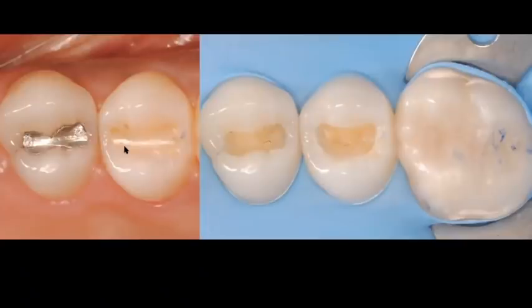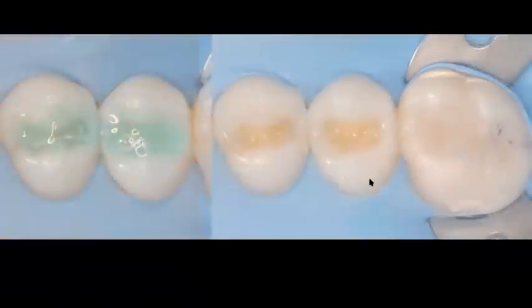You adapt them well to the tooth. They do adapt well to the tooth, but I don't see them functioning very well because they really don't have any tooth form or tooth shape. And the reason why they don't have it is because we're just placing 2 to 3 horizontal layers. We're making a flat restoration from the beginning. So the successive cusp buildup technique is a technique where we are going to change our mentality and go from that horizontal layering technique to a combination of a horizontal and oblique layering technique so that we can build our occlusal anatomy from the get-go. So from when we get started.